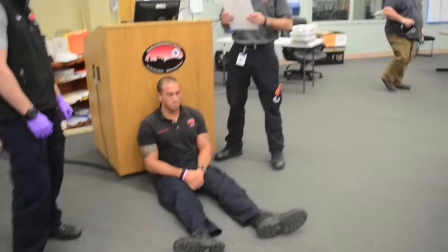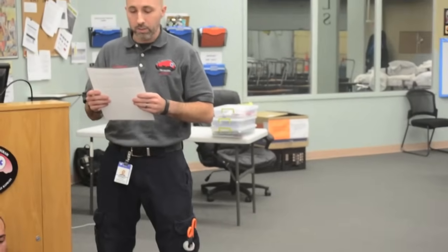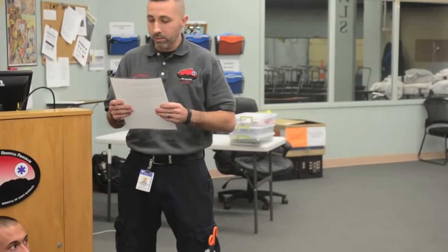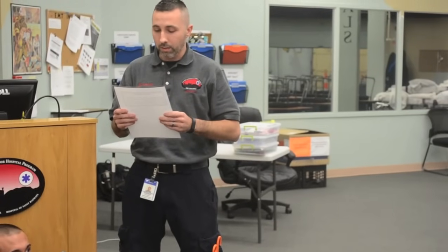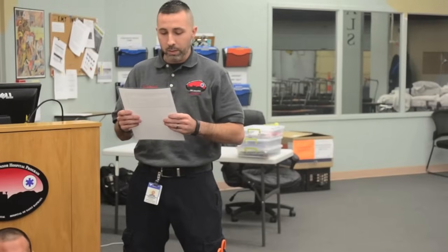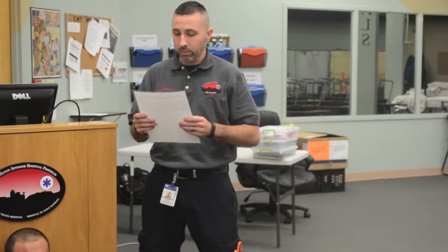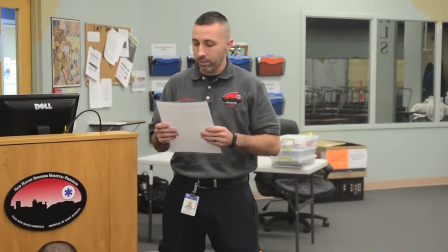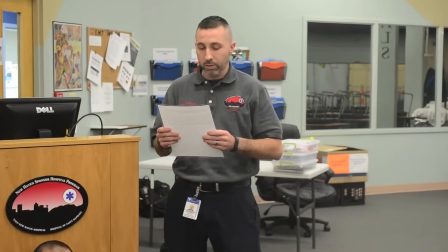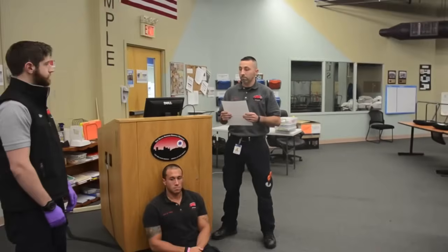The scene survey and primary survey have been completed and the suspected closed non-angulated fracture of the right tibia is discovered during the secondary survey. Continued assessment of the patient's airway, breathing, and central circulation is not necessary in this skill. You may use any equipment available in this room. You have five minutes to complete this skill. Do you have any questions? I do not. You may begin.